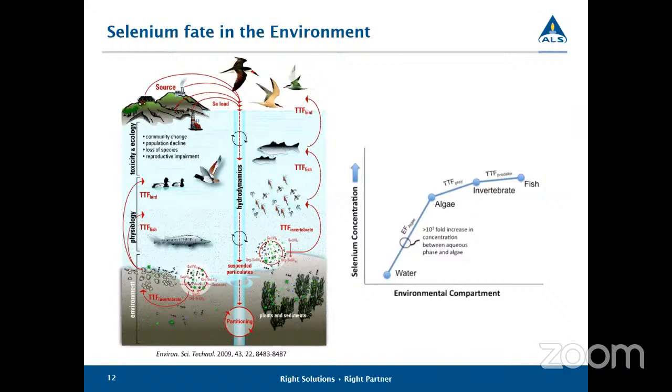I would say that there's a possibility that on the sampling side, there may be challenges with things like a lot of iron in an anoxic environment. This would be something we would probably want to know ahead of time with the client, and maybe we can come up with a recommendation. Things like pore waters or taking water out of peepers, I think they're called. If it's very anoxic, you might start to get precipitation before you've even put it in a bottle.